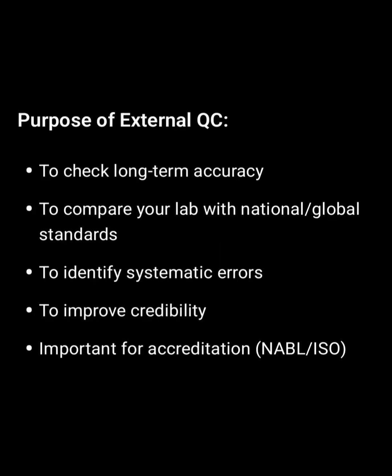Purpose of external QC: to check long-term accuracy, to compare your lab with national and global standards, to identify systematic errors, to improve credibility, important for accreditation of NABL and ISO.